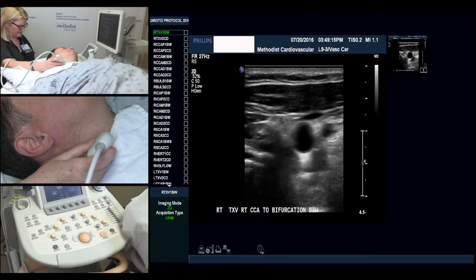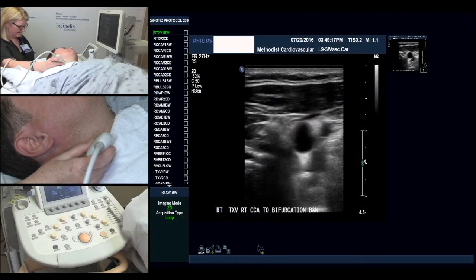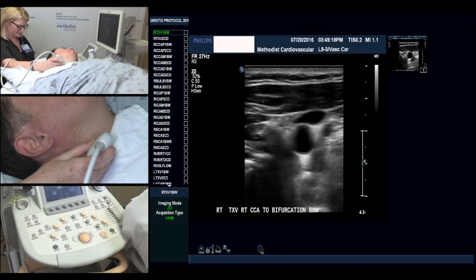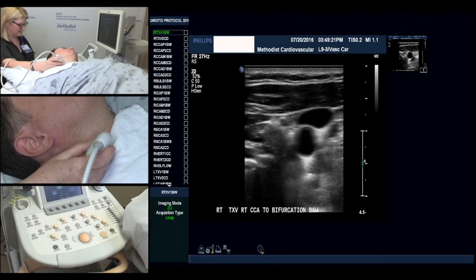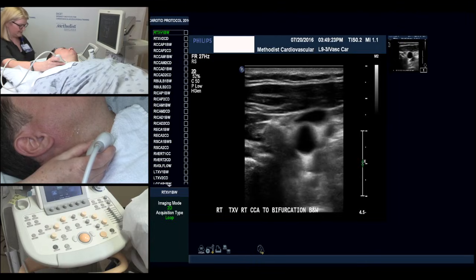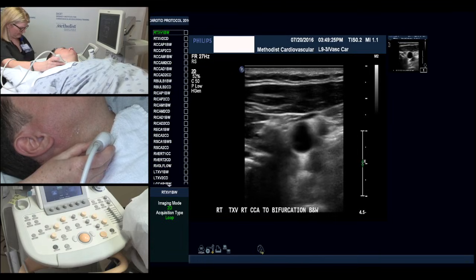Hello, my name is Esther Collado. I'm the technical director of the vascular lab, cardiovascular surgery associates at the Houston Methodist Hospital. Today I'll be demonstrating our carotid protocol.